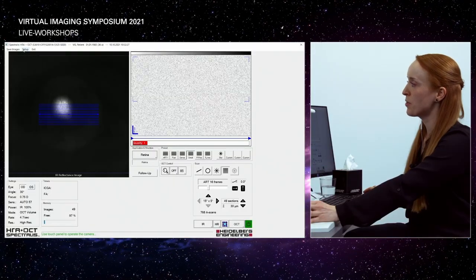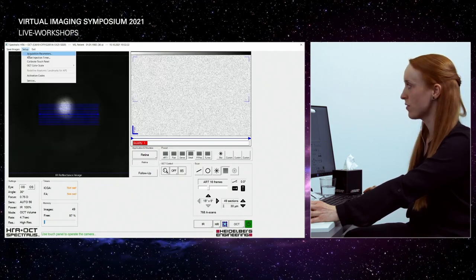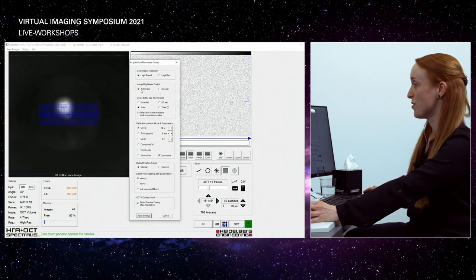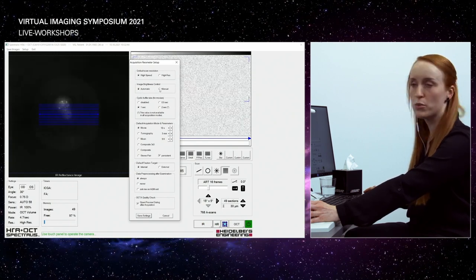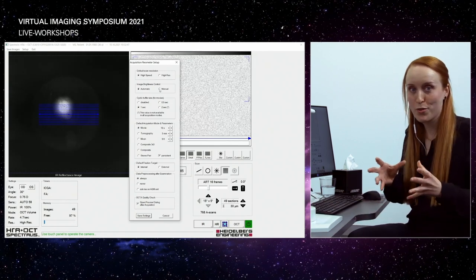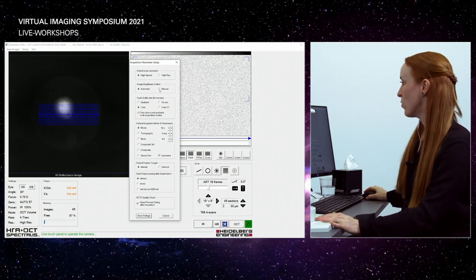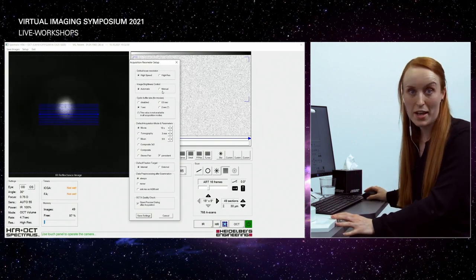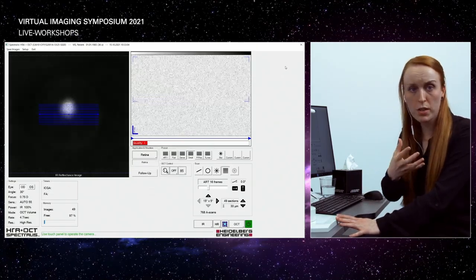As a default setting, first of all, you can change it right here in the acquisition window, clicking on Setup and Acquisition Parameters, okay? And there you find, in the second row, the Image Brightness Control. It's automatic right here, so the system just controls the brightness, but you can set it to manual as well. So there you have the control of brightness of the fundus image, okay? So we will leave it here. After activating it and restarting the software, then it's active, okay? Otherwise, you can just change it for one examination, maybe in case you need it, okay?